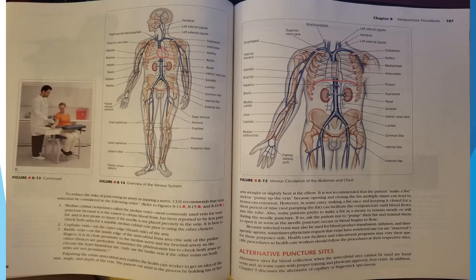Palpating the entire antecubital area enables the healthcare worker to get an idea of the size, angle, and depth of the vein. The patient can assist in the process by holding his or her arm straight or slightly bent at the elbow. It is not recommended that the patient make a fist and/or pump up the vein because opening and closing the fist multiple times can lead to hemoconcentration. However, in some cases, making a fist once and keeping it closed for a short period of time, not pumping the fist, can facilitate the venipuncture until blood flows into the tube.